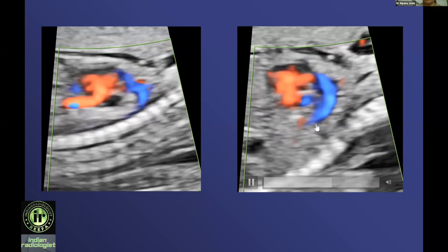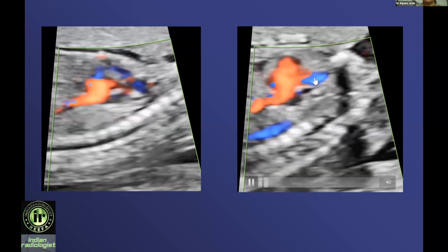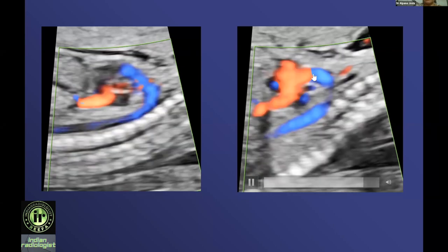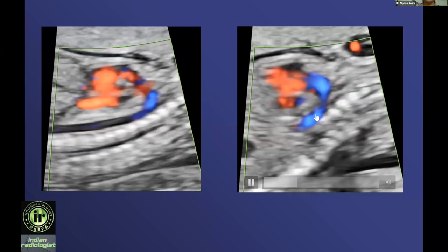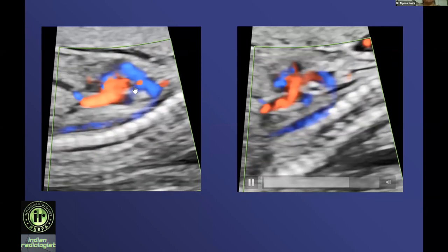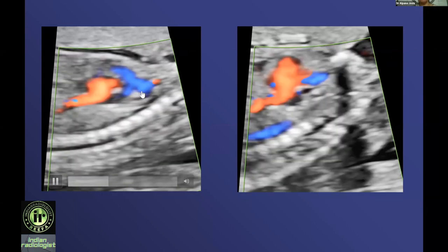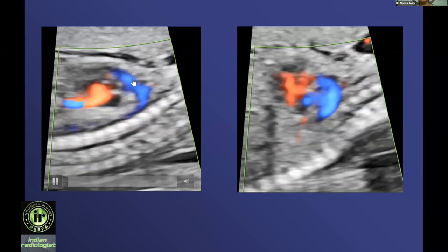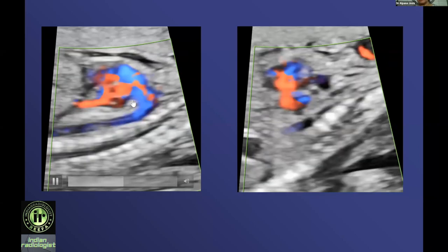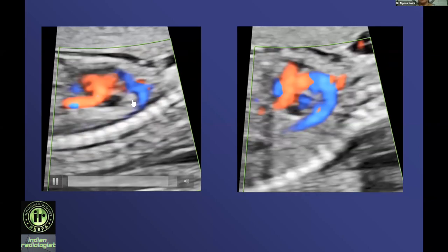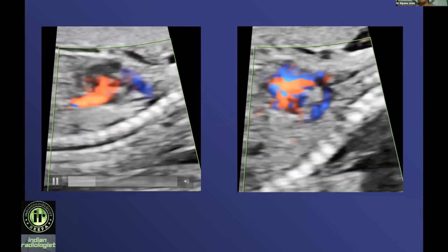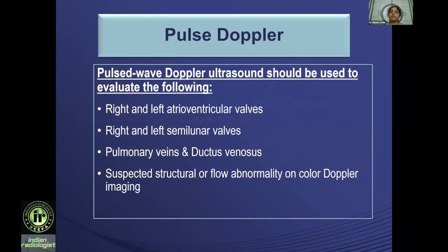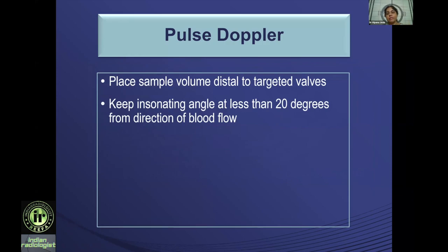This is how you will see the arch views — the aortic arch and the ductal arch. The highest arch is the aortic arch, and then there is the ductal arch seen a little below that. If you observe, both are seen in this view: this is the aortic arch which is a little superior, and the one going behind below that is the ductal arch.